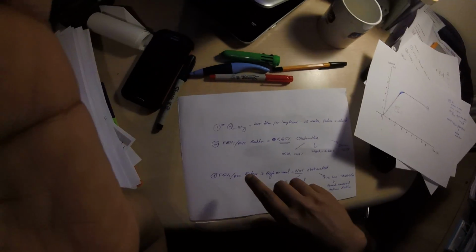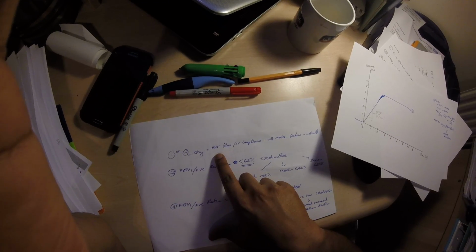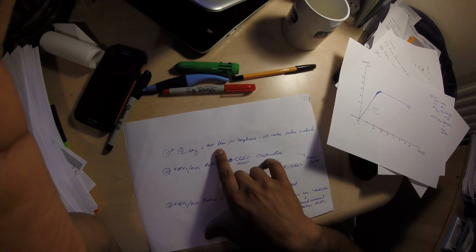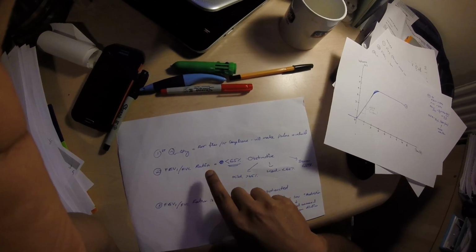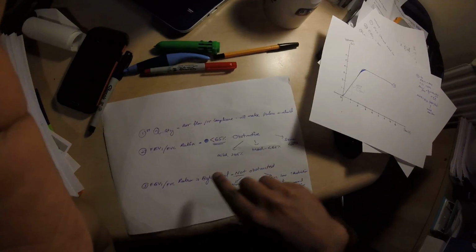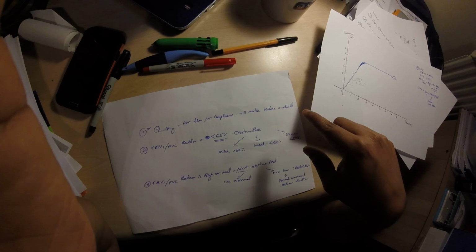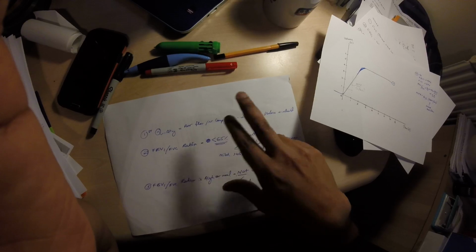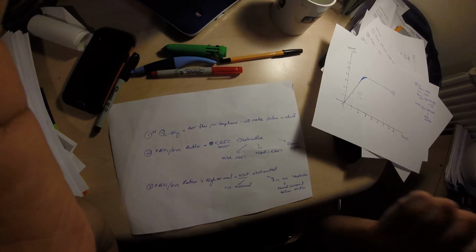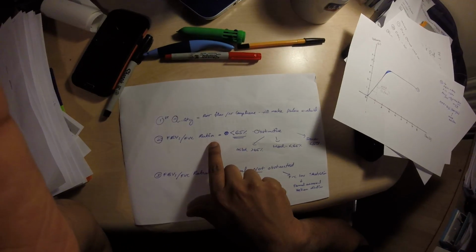Interpreting these results also is based on the quality, which can sometimes be poor flow, but it can be compliance related, so it can be patient related, and it can skew the data that we get. So we have to make sure the data is correct before we interpret it. Number 2 is the FEV1 and FVC ratio.